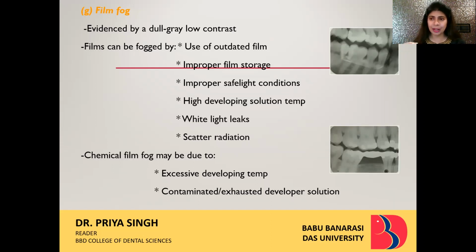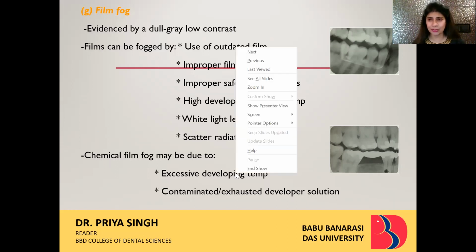So keep the artifacts also with you so that next time you remember that if you do some mishandling, if you do this particular thing improperly, it can lead to artifact, maybe during the technique, maybe during the processing. And even if everything has been done properly, if you have not dried that radiograph before placing it in the envelope, even then, and maybe beyond the time it's in the envelope. So it is important that you preserve these radiographs so that the patient is not exposed more than once while investigating a particular pathology. Thank you.